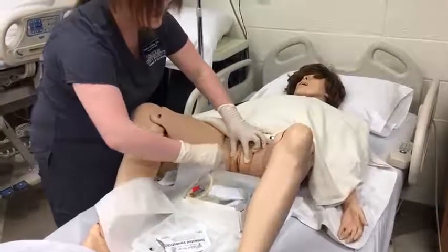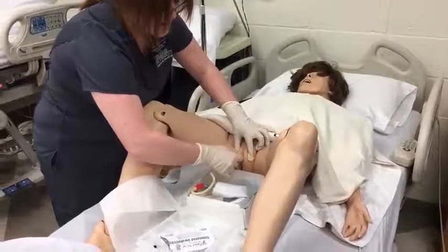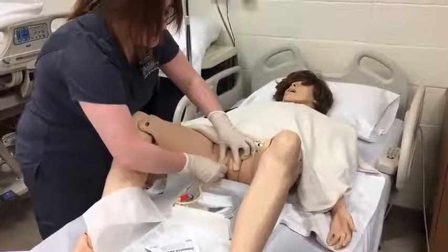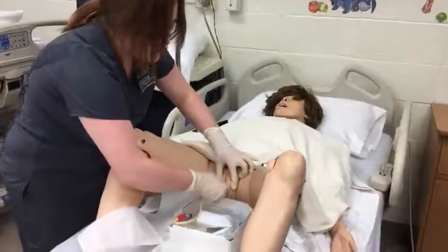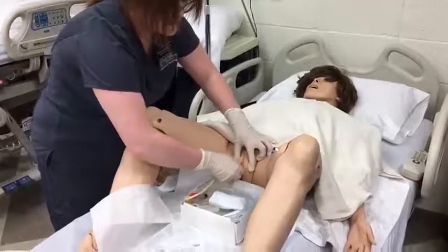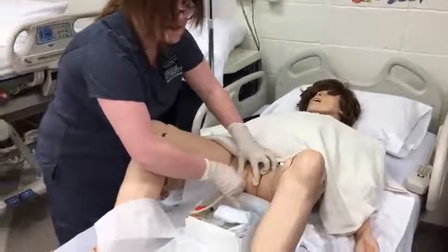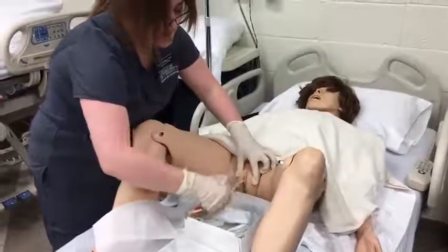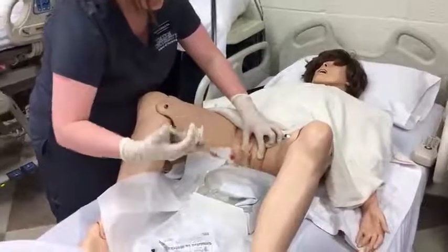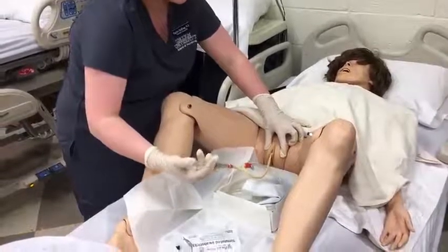I'm going to instruct the patient to take a deep breath and bear down as if she's trying to void. And I'm going to insert this into the urethra, and insert until I see urine return. Now, if the catheter were to slip or go into the vagina, you would have to restart your entire process because it's no longer sterile. Once you see urine flow, you push it another 2 inches past. If the patient feels excessive pain or pressure at any time, you want to dial back on this.